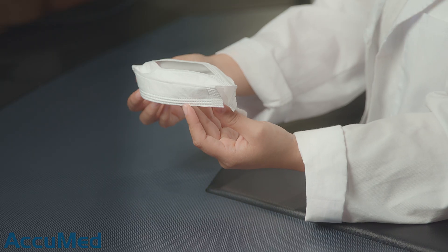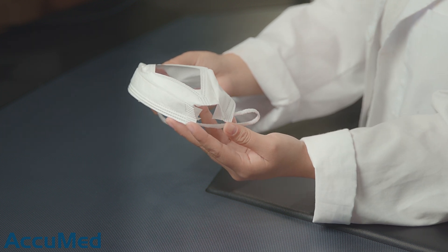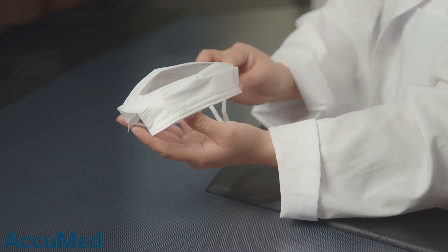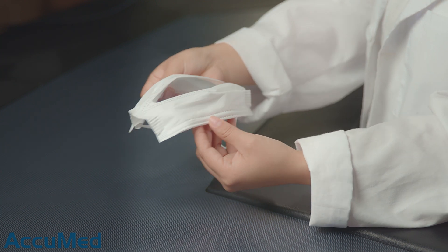As you guys saw from the TSI test results, unfortunately these are not a mask that we can recommend. I made sure to test it flat and it gave us a pressure drop of over 100 millimeters of water, which is obviously extremely high. Another sample I tested folded a little bit so that it could have more surface area, but although the pressure drop did go down it was still very high. So overall the test results were failing for the ASTM level 3 requirements.